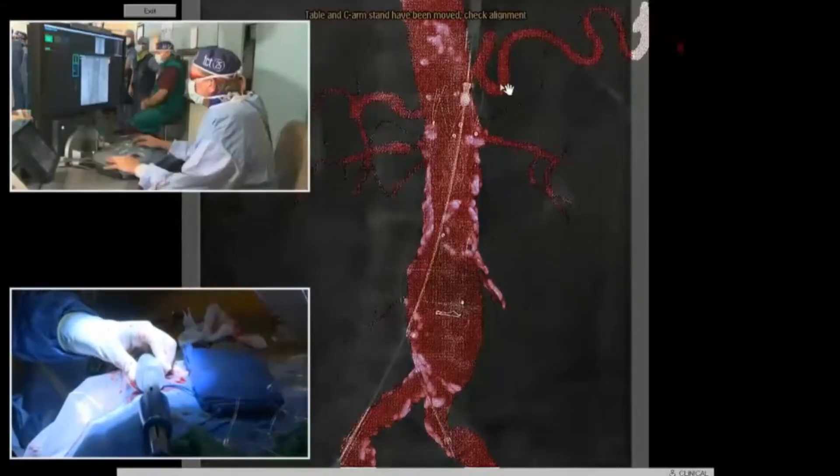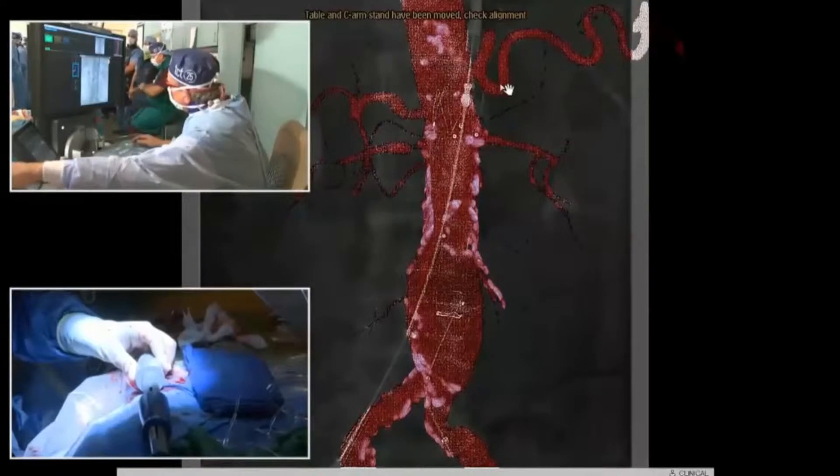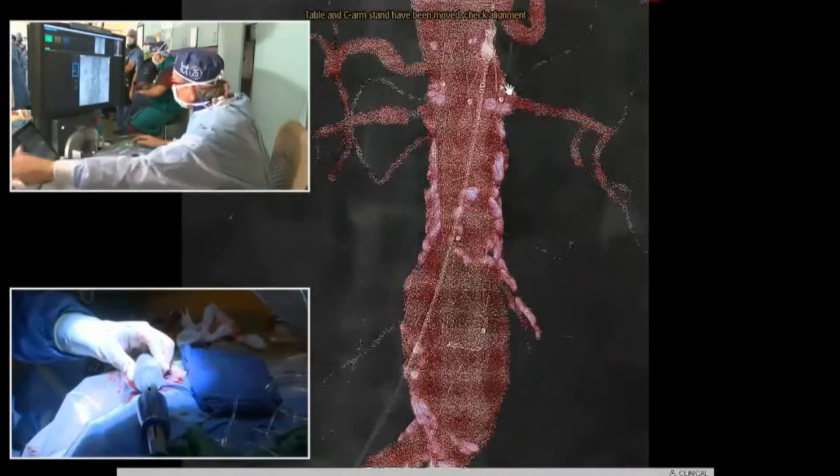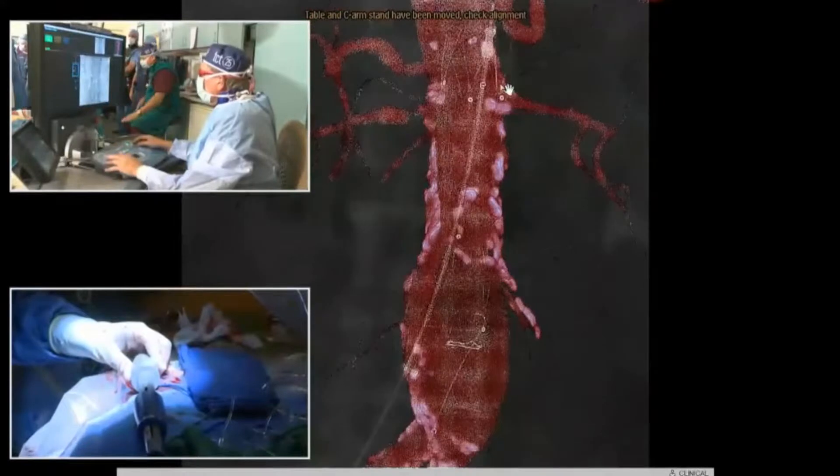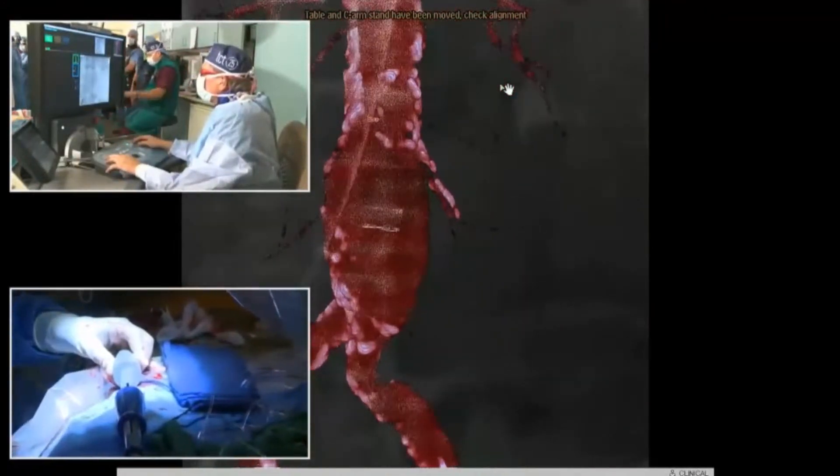When we work with fellows and they don't move the wire well, you see that before them, even before they know they're not moving the wire right. I was just about to say that - we experience that every day. You know exactly what they should be doing and you don't have your hands on the wire.